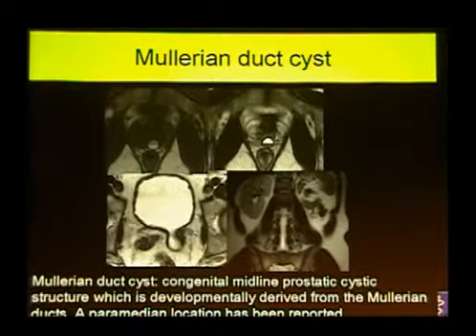There's only one paper that showed that utricular cysts usually happen in younger patients and are a little bit more severe.